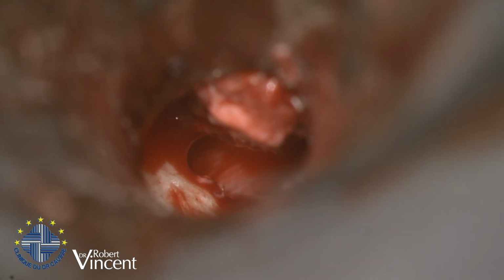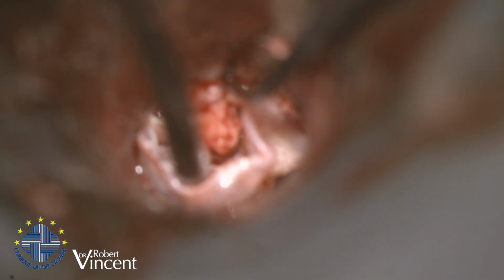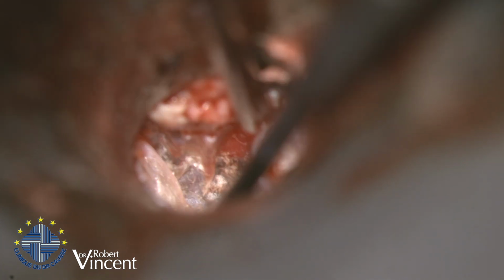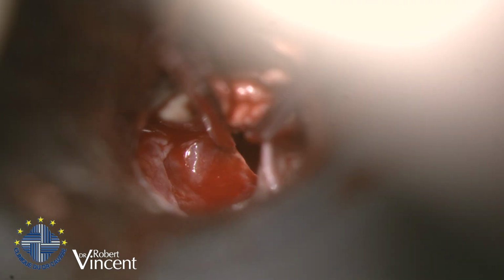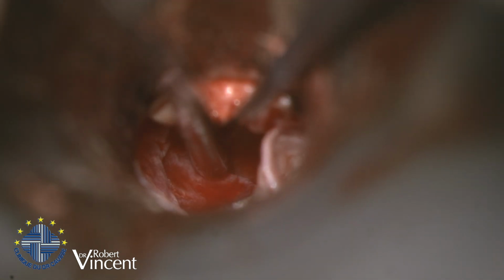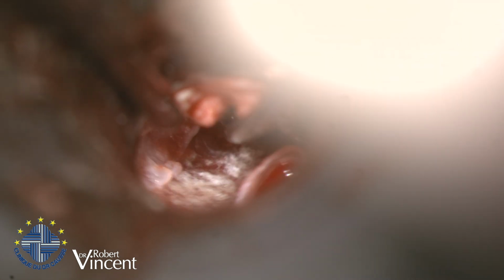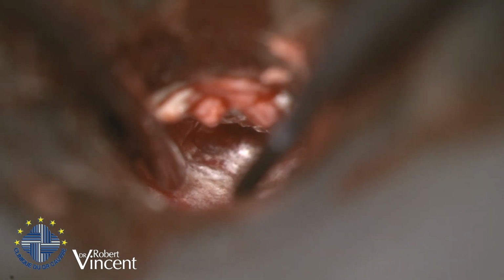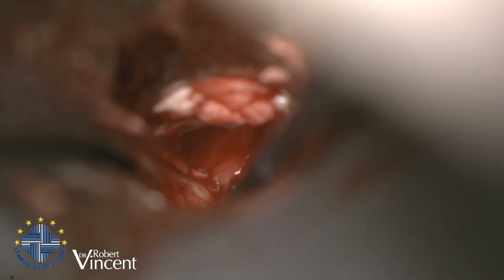Okay, so I will first try to place the perichondrium graft, mainly to reinforce the drum at the posterior superior part of the drum because it was pretty atrophic. So this is just for the tympanic membrane, but it's not enough for the titanium prosthesis, of course. We need to use cartilage. Okay, looks good. I will now stick it to the tympanic membrane, and it's going to be fine. Okay, that is good.